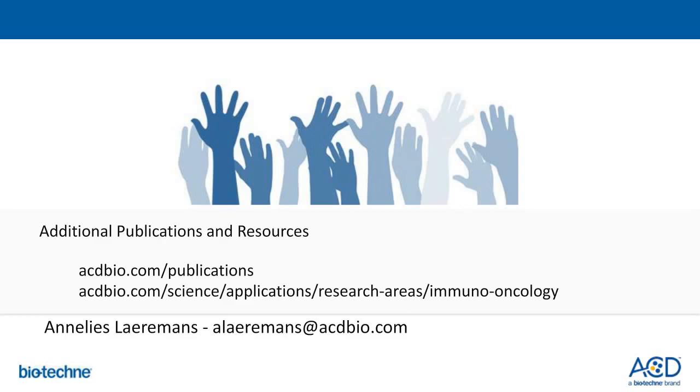Our first question is, what is the recommended thickness for FFPE samples? So for FFPE samples, we recommend to use a tissue section with a thickness between 4 and 6 micrometers.